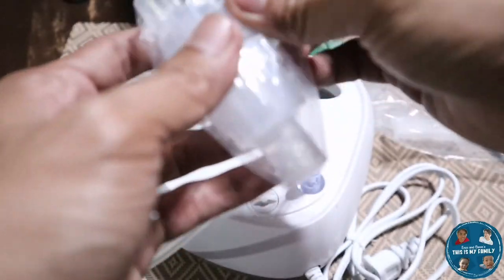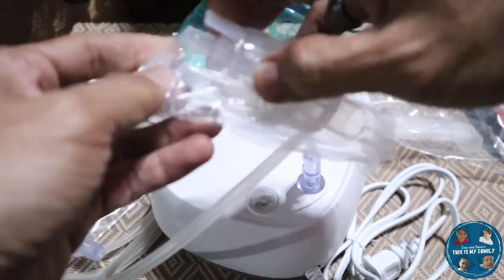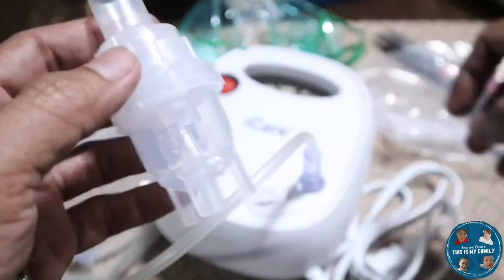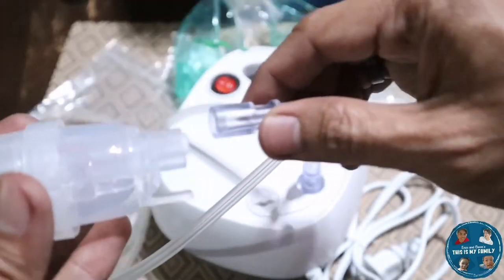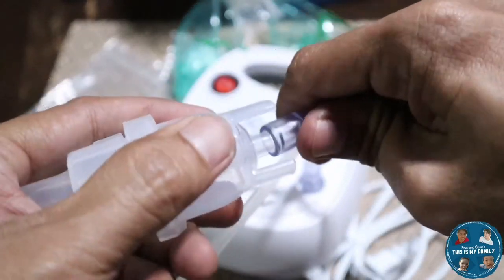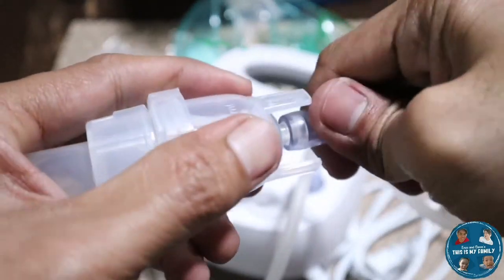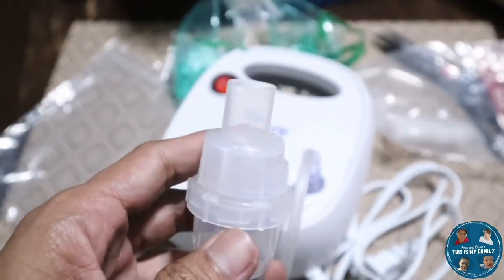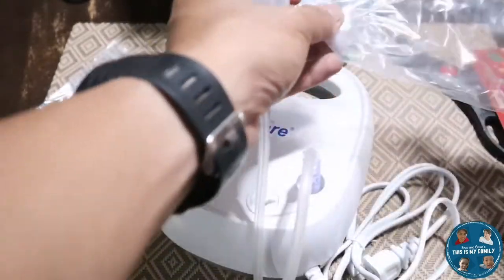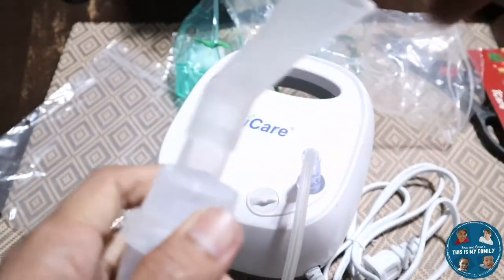Then this is the mouthpiece. The nebulizer kit. This is where you put the nebule. Okay. Let's put the other end of the hose here. You have to try a little bit, so that's it. And the mouthpiece. Okay, easy peasy.